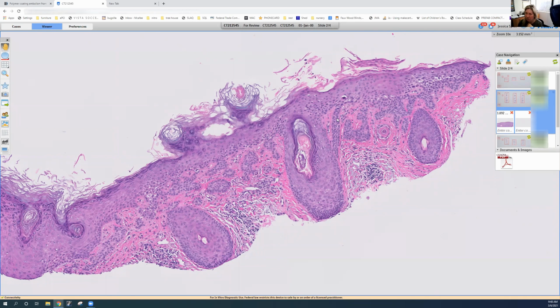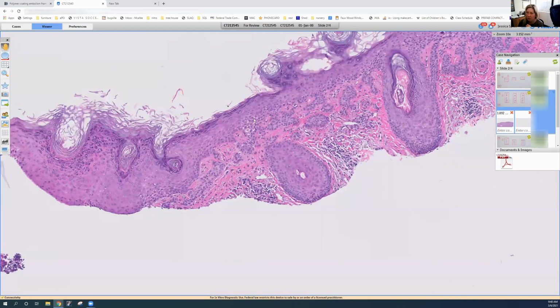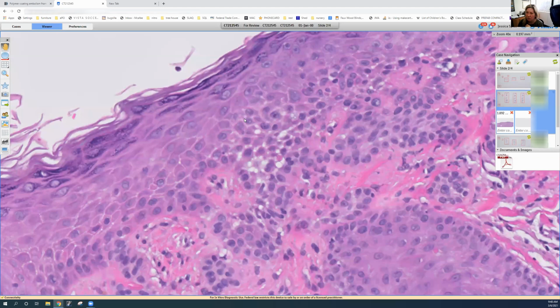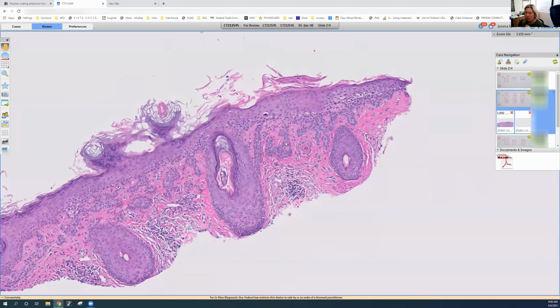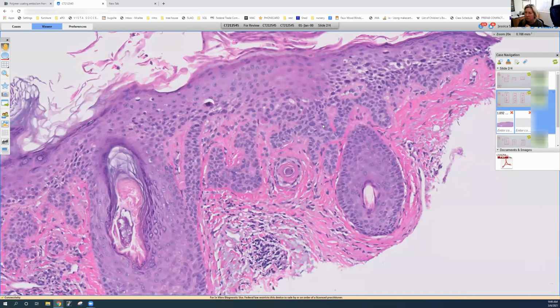And in the epidermis, it has the boy-girl sign, the pink and blue sign, which is pink epidermis with overlying pink parakeratosis, sparing the follicle, which is blue, and the follicular basket weave stratum corneum over the follicle. These correspond to each other. So this is the pink, blue, and here we have a little bit of pink actually also. This is a clue to actinic keratosis. And actinic keratosis can have this budding pattern. We call that a hyperplastic pattern colloquially.